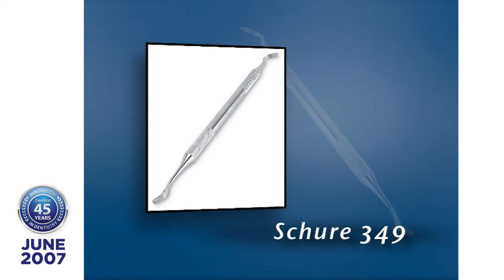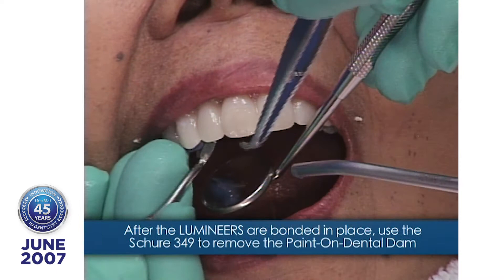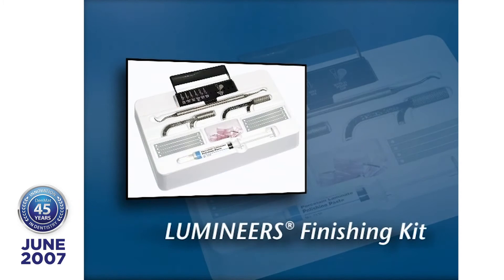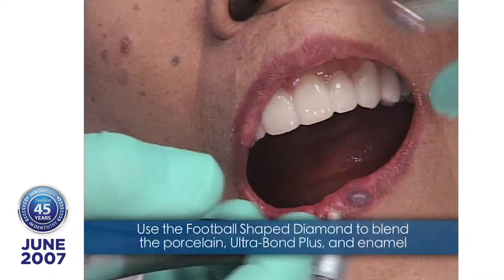Let's see what we got in here. Look how nice that lingual looks right now. Now I'm taking the football-shaped diamond here — all of these are in the clinician's finishing kit. Remember the foundation for lumineers: they're caries-free, they're perio-free, and their occlusion is equilibrated. If it's not, you'll have to equilibrate it after you put the porcelain veneers on.